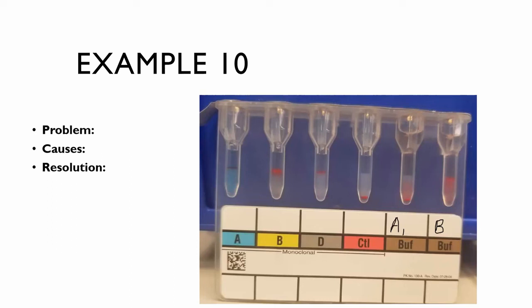If you suspected this was Rouleaux, you would switch to tube and view it in the microscope to see if you have the stack of coins appearance. If you see that, to prove that it's Rouleaux, you have to spin down your reverse reaction again.